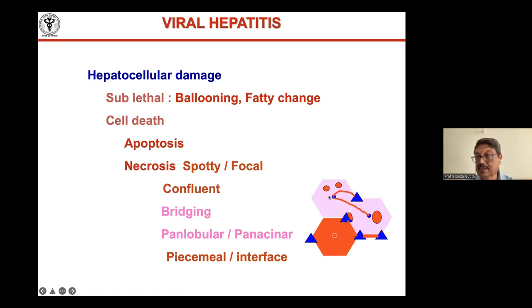Naturally, this type of bridging necrosis is worse from terminal hepatic venule to portal tract, because it causes an intrahepatic portosystemic shunt. That's worse than central to central, like you see in Budd-Chiari and veno-occlusive disease. Okay, right? So these are the different patterns.